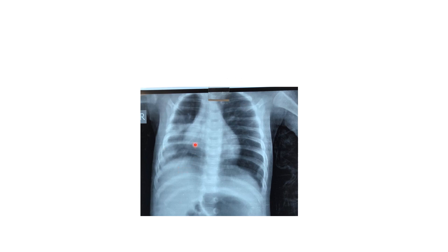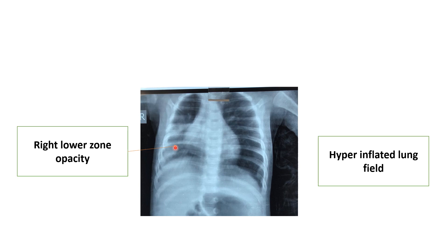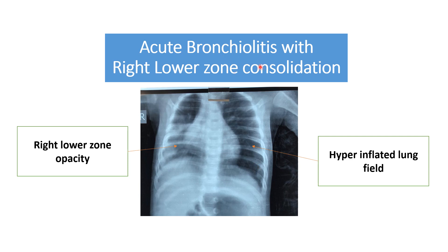In this x-ray, an opacity is present — this is the x-ray of an infant having signs and symptoms of respiratory distress, fever, and cough. In the right lower zone you can see opacity with air bronchogram, which is seen in consolidation. The lung field is expanded beyond the seventh rib, so we label it as a hyperinflated lung field. This infant was having acute bronchiolitis with right lower zone consolidation.